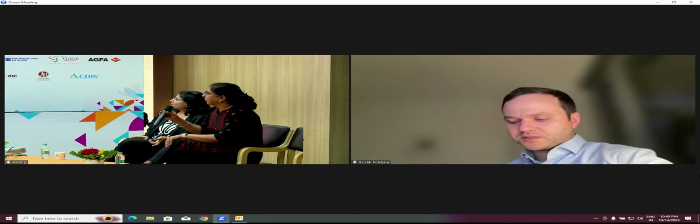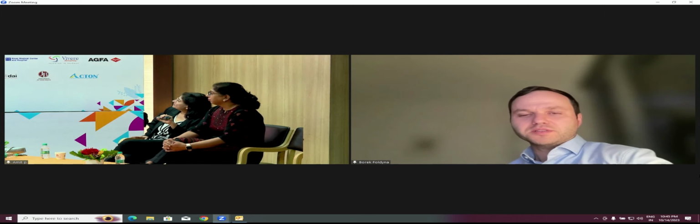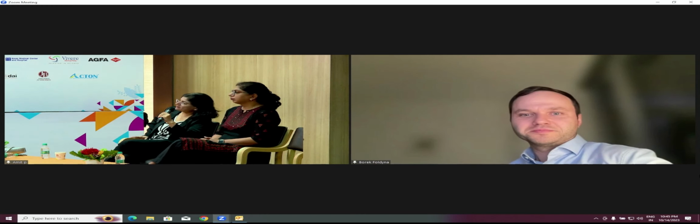No, that's true. And if the cardiologist really wants to know whether there is an ASD that is relevant, they usually do a bubble study, right? So it's not really a CT or MR decision usually. When the patients come to us, the ASD is usually known and they just want to know the measurements. Yeah, because you sometimes have these aneurysmal septums. That's why I prefer the MR, because at least you can see the flow and quantitate it, as well as look at the rims. But thank you. Great talk.